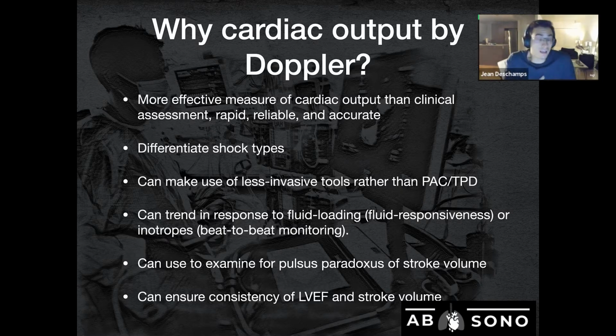The other thing I use it for is when I have a PA catheter and I'm looking at a number, and I'm like, ooh, I'm not sure this is right or not. It might be TR or something like that. I use it to calibrate my PA catheter and see if it's accurate or not. If I get two numbers that are similar, then I know I've validated the number from my PA catheter, and that makes it more useful later. So that's another way I've used it on a pretty frequent basis, I have to say, when I think about it.